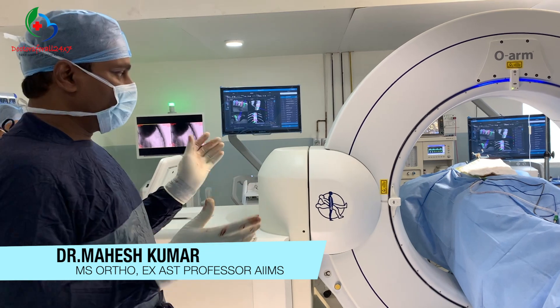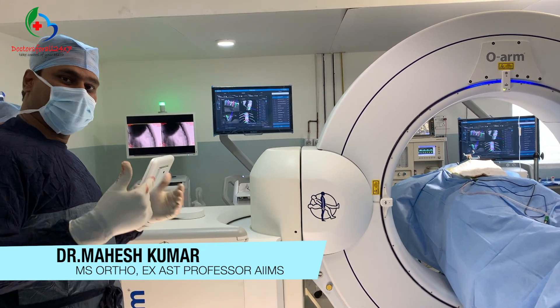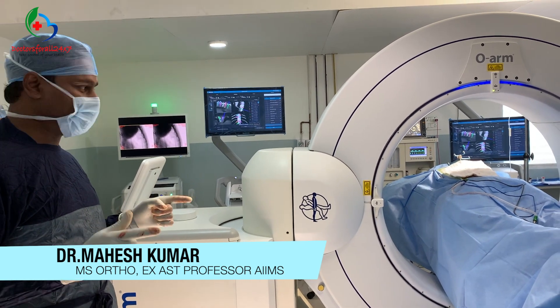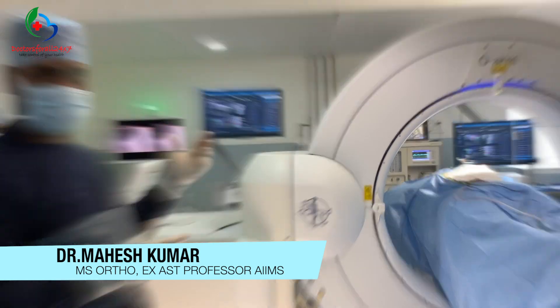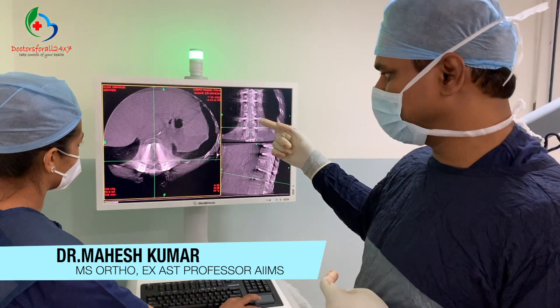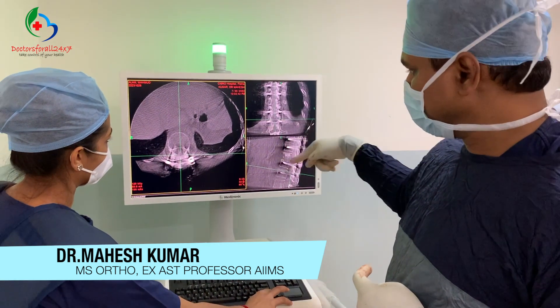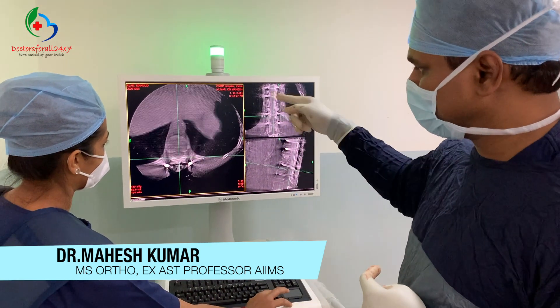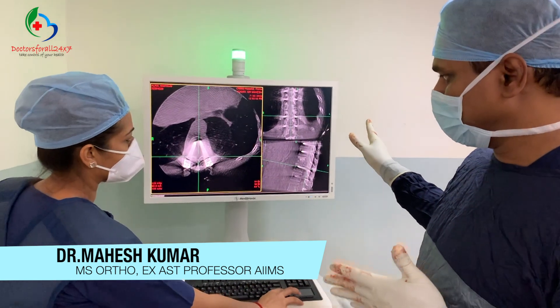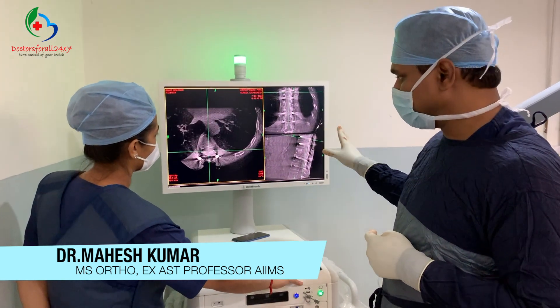At the end of surgery, as a whole, the system gives you precision in performing the procedure. That is the magic of O-Arm. This is the final picture taken by the O-Arm after surgery, which has been transferred to the screen. You can see that all the screws have been well placed. In 2D and 3D, we can have a clear picture of what has been done in the surgery — all the screws have been perfectly placed and there is no error.